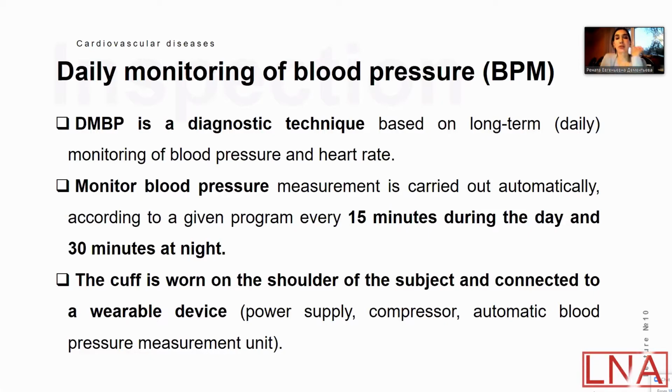You can also change the program and exclude the voice signal before each blood pressure measurement. Because in the classical program, before the start of the measurement, the patient will hear some voice signal from the monitor. It's not very comfortable during the night, and you can exclude this voice for better sleeping and to give the patient more comfortable conditions, for real results, and assess these results.